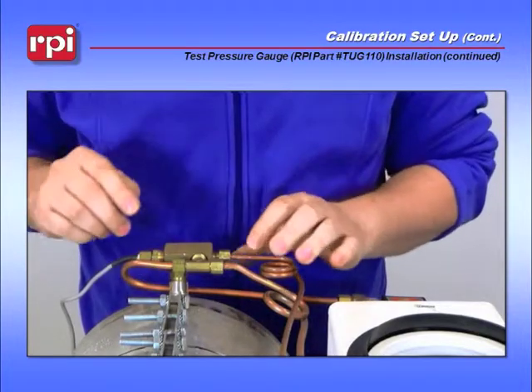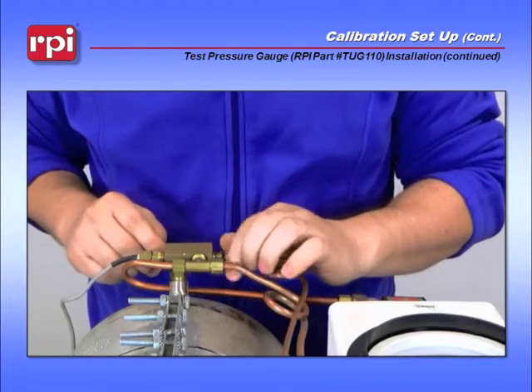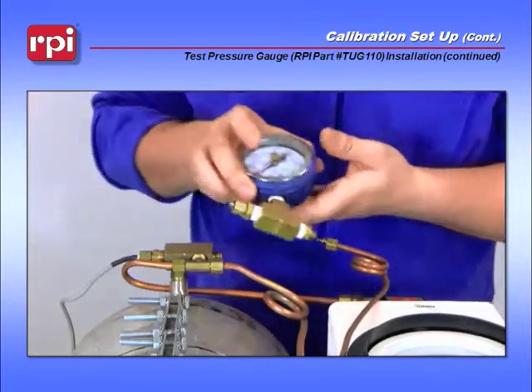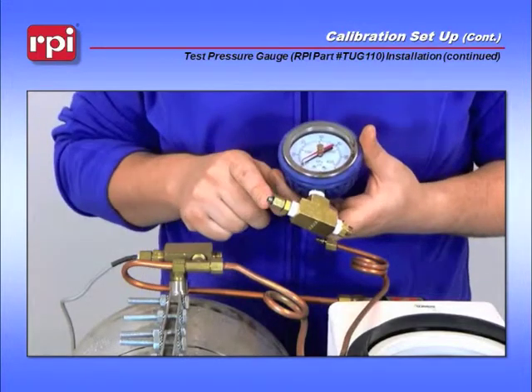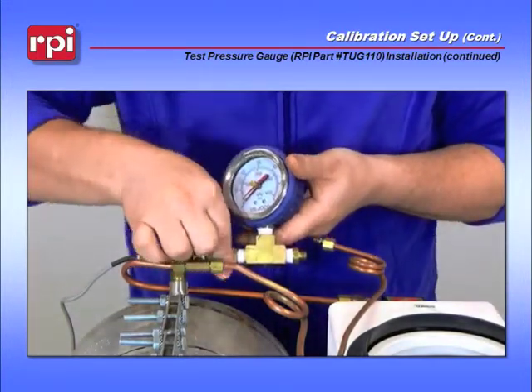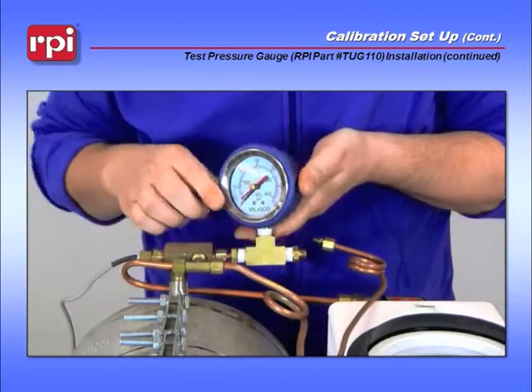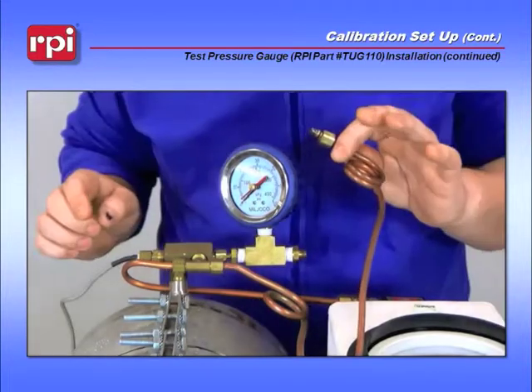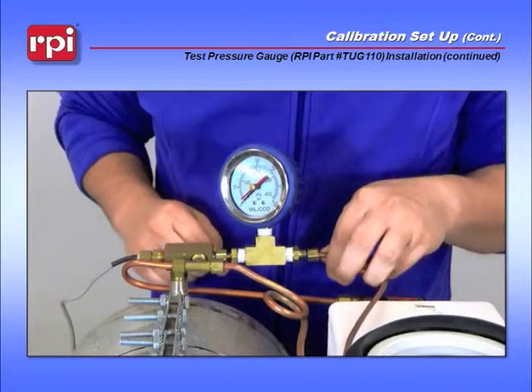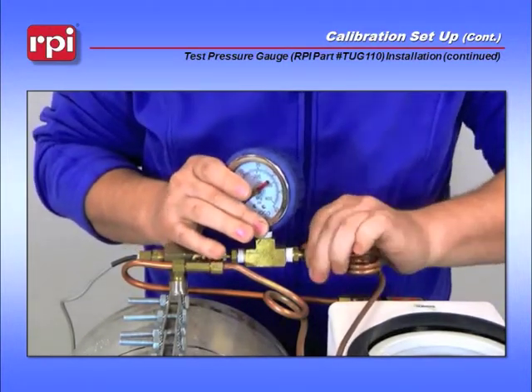As you look at it from the back, you need to disconnect the compression fitting on the left-hand side of the machine. Grab your test pressure gauge and install the small end into the T. Screw it down until it's finger-tight. Then take the other end — the part of the tubing that is connected to your pressure transducer — and connect it into the other end of the test pressure gauge, and again tighten until finger-tight.